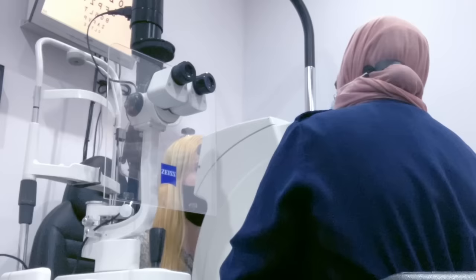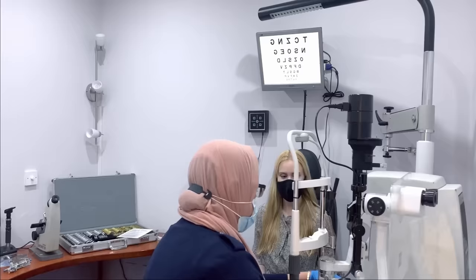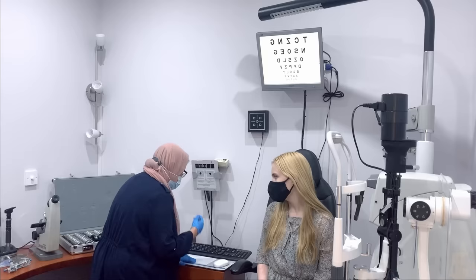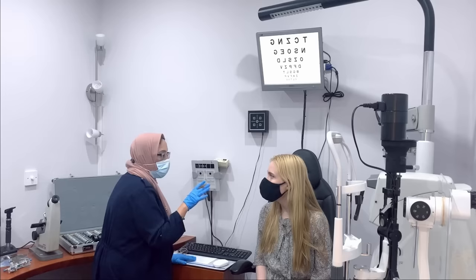Thank you. Okay. So your pressures are, the average is 15 and 13, which is actually fine. Okay? Good. That's great. So that's measuring the eyeball pressure. We always do that. You've heard about a disease called glaucoma? Yes. Yeah, so glaucoma is characterised by many things, of which one of them is high pressure, basically. But it's a group of diseases characterised by different things. So what we do for everyone is we just make sure we've got a base pressure reading, so that we can always monitor that, okay?